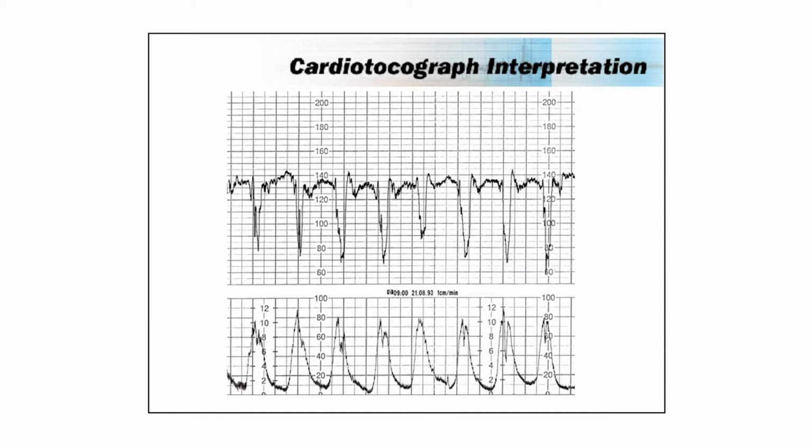Position of the baby, descent, rotation, etc. All those other factors will feature into your decision making. So for example, if I said to you, this is a mother, this is her second pregnancy, she's at term, a previous spontaneous vaginal birth 2 years ago, and the vertex, cephalic presentation, and the vertex is at the spines. 0. You would think, okay, I'm pretty happy with this.